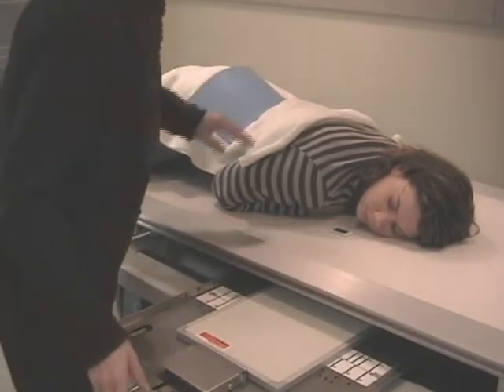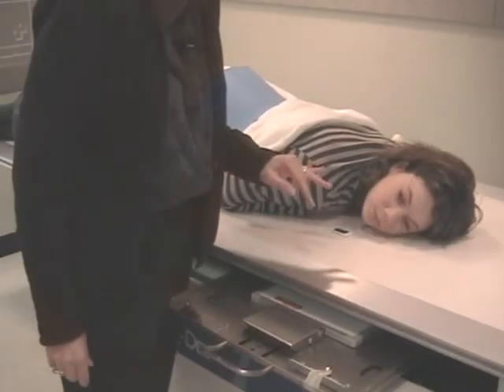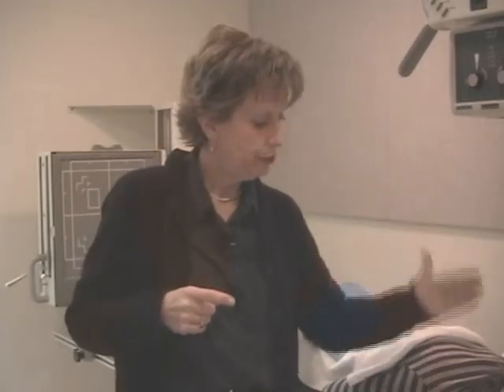Before I tweak my patient, let me tell you what lines I'm going to focus on: the inner pupillary line and the MSP again. The inner pupillary line will be perpendicular to the table, and the MSP will be parallel.